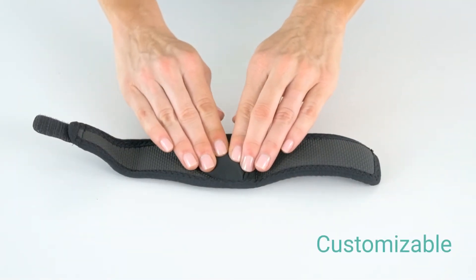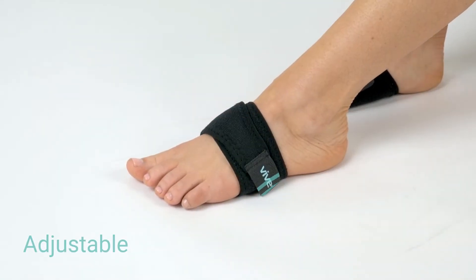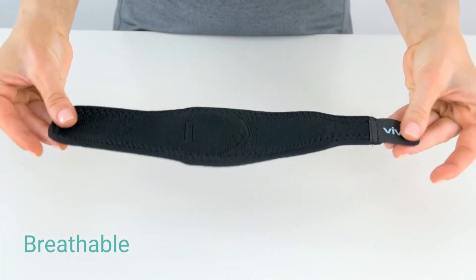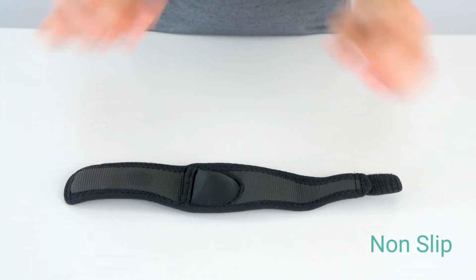Soft gel inserts provide added comfort and support. Strong adjustable fasteners secure the brace for optimal compression. Breathable, latex-free material allows your foot to remain cool and dry all day, while the non-slip rubber lining prevents bunching.